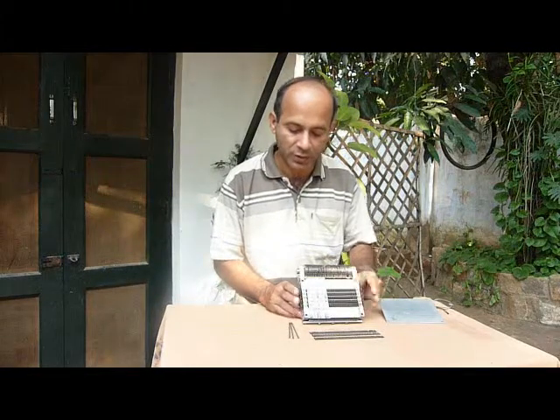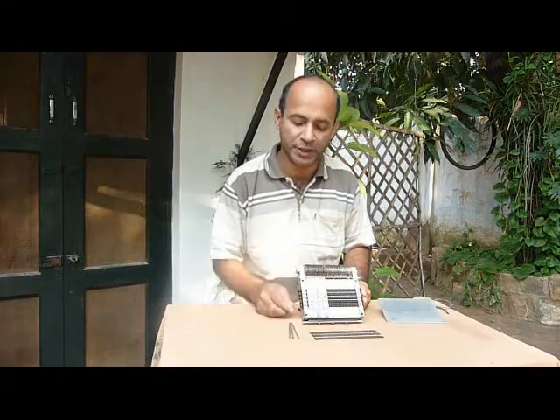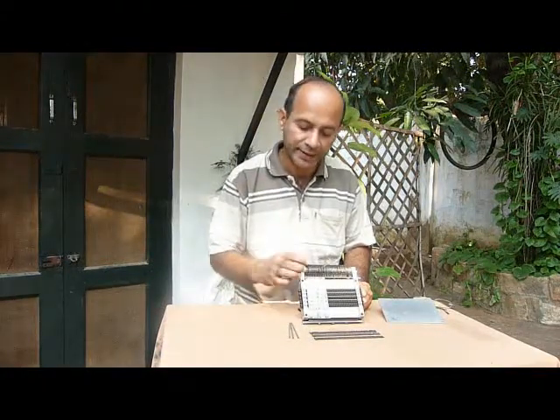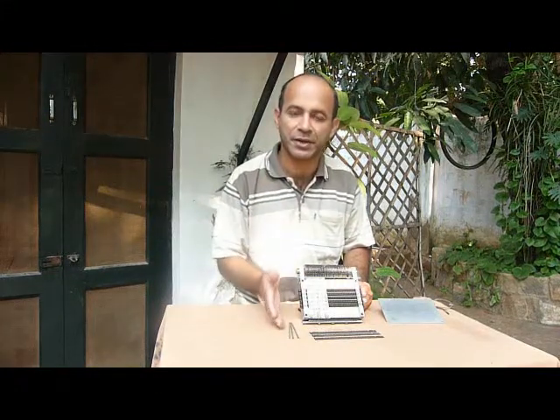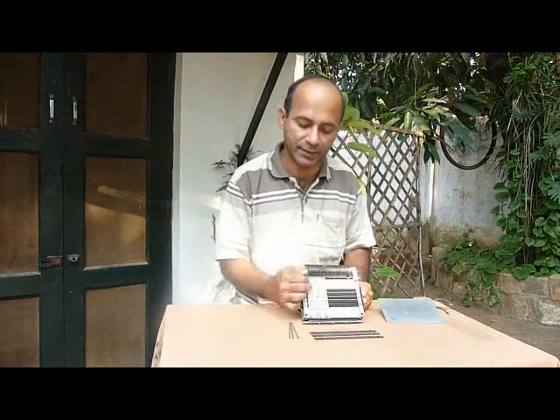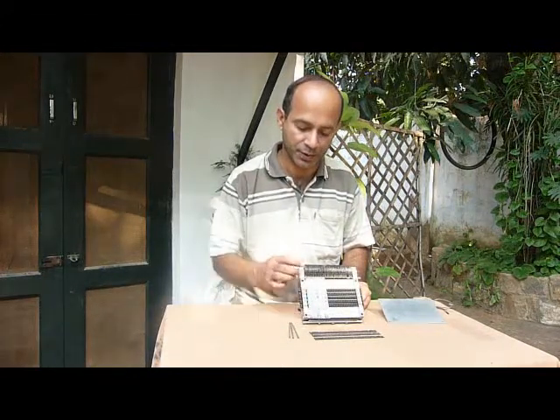I've converted the row slide underneath each pin into a little actuating mechanism. It's basically like pushing a little wedge under each pin. So the pins that would have, say, the data 1 would have the wedge pushed under them, and they pop up again. Then at that point, the slide is closed again. So you've dropped everything to 0, you've pushed your wedges under the pins in the column that you want, the pins that you want in the 1 position, and then you've locked it again. So you've got some pins up and some pins down, depending on your information, locked in their appropriate position.